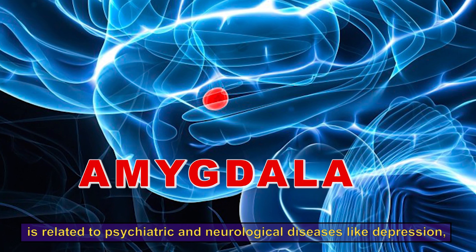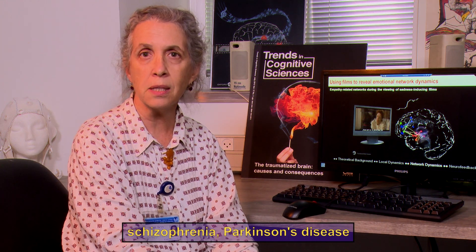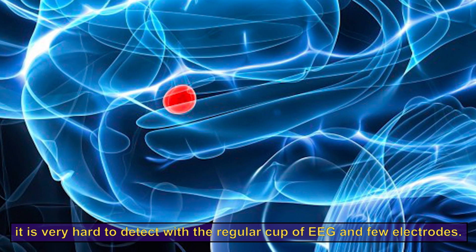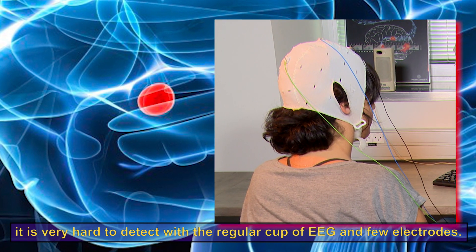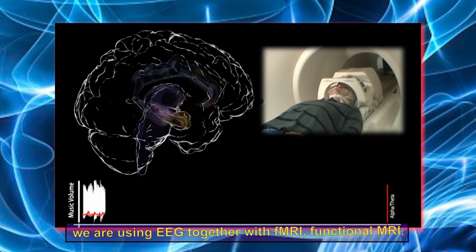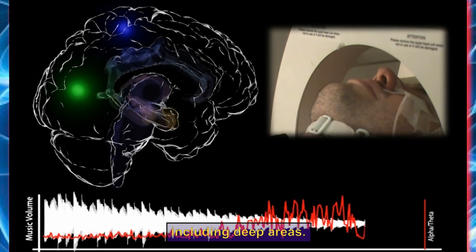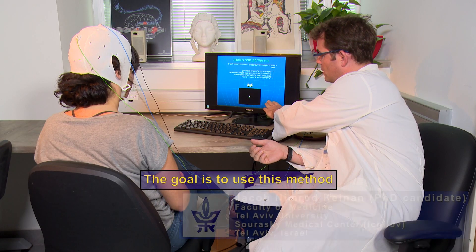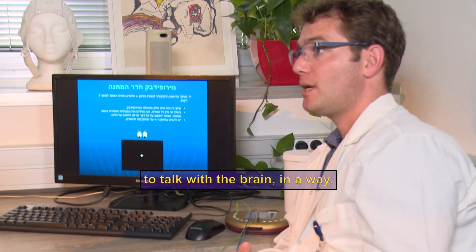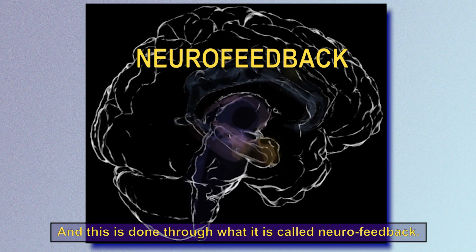The amygdala is important in psychiatric and neurological diseases like depression, schizophrenia, Parkinson's disease and Alzheimer's. Since it is located so deep in the brain, it is very hard to detect with a regular EEG cap and few electrodes. To improve these methods, we use EEG together with fMRI — functional MRI — which is a good method to detect activity across the brain including deep areas. The goal is to give people a tool to communicate with the brain and train themselves to modulate brain areas through neurofeedback.